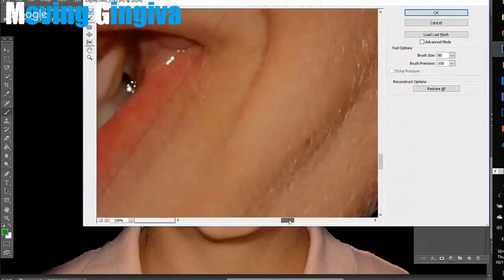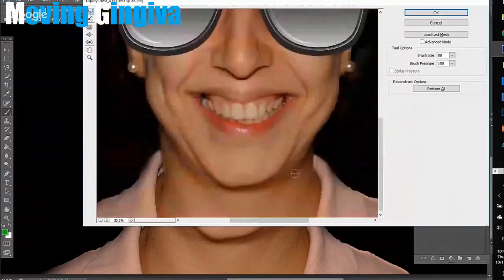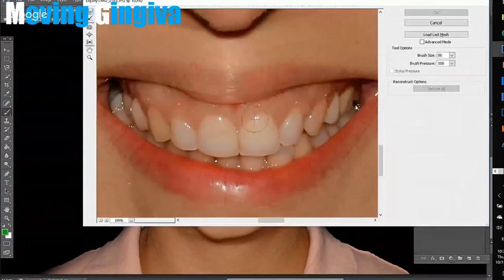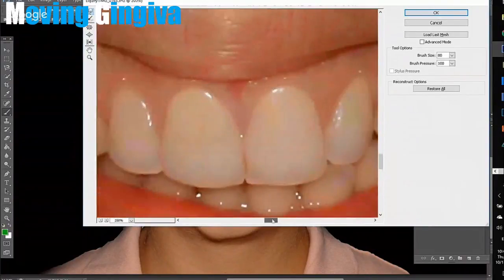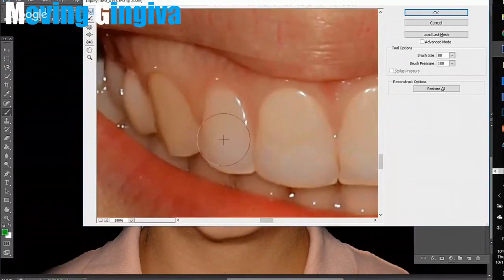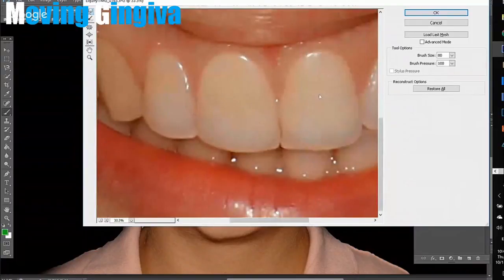This is really amazing. I think this is the best method to simulate a gingivectomy. And I'm not being a fanatic like the Apple Samsung people. No, I'm not doing that. But you can really notice what difference it makes to be able to use this tool and simply increase the length of the teeth virtually.